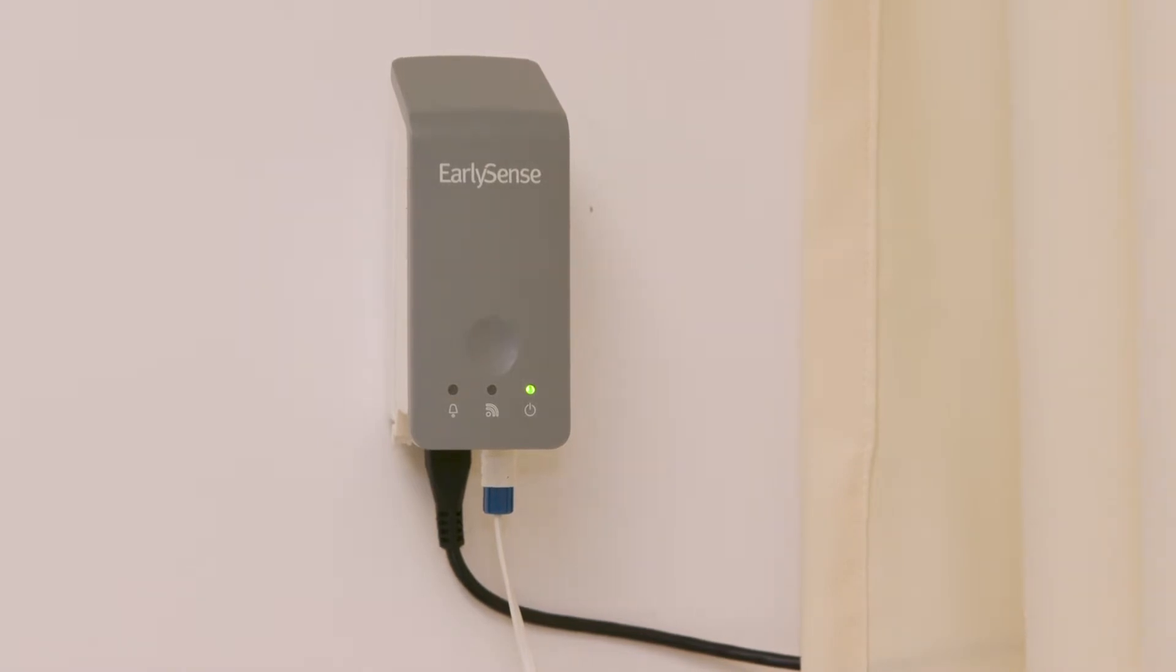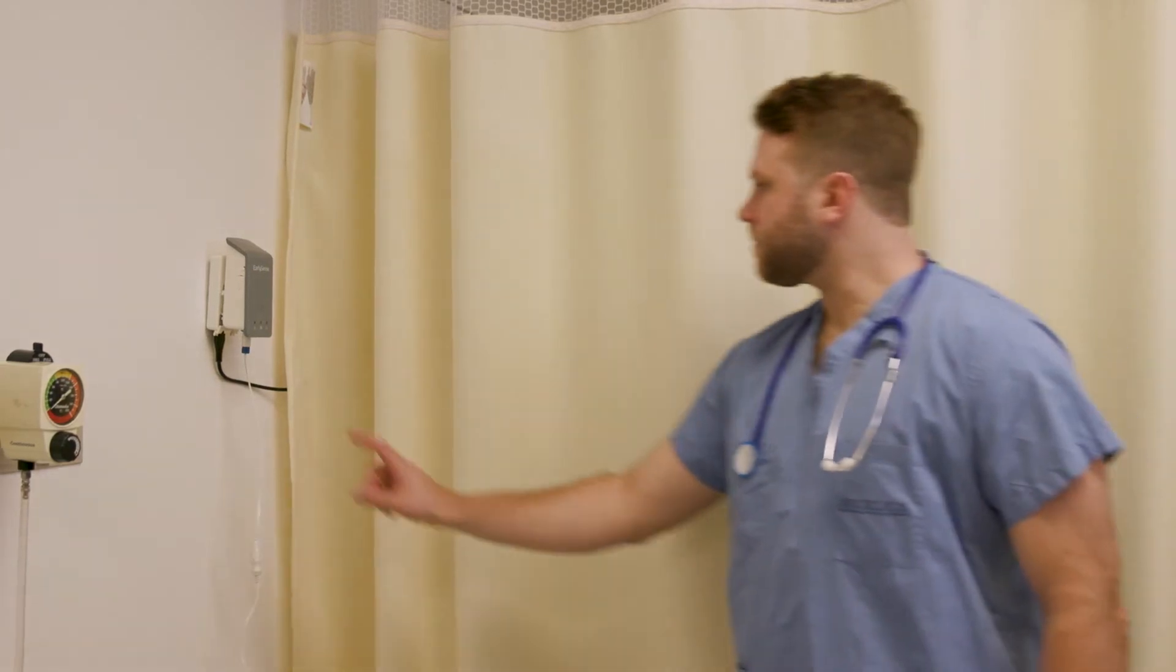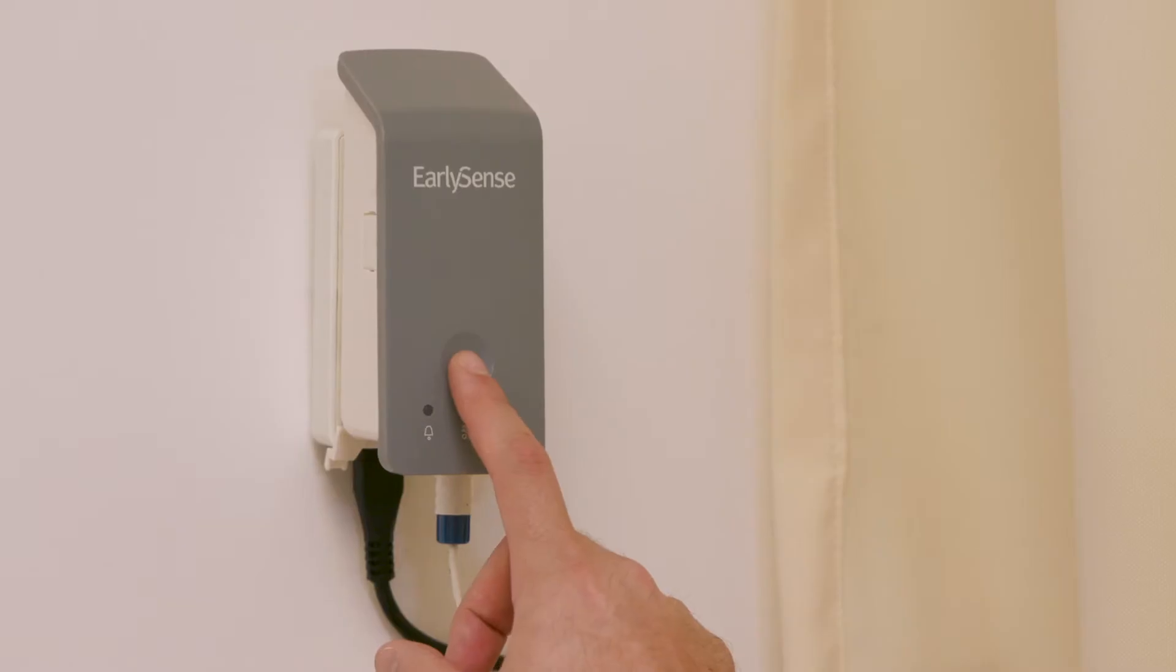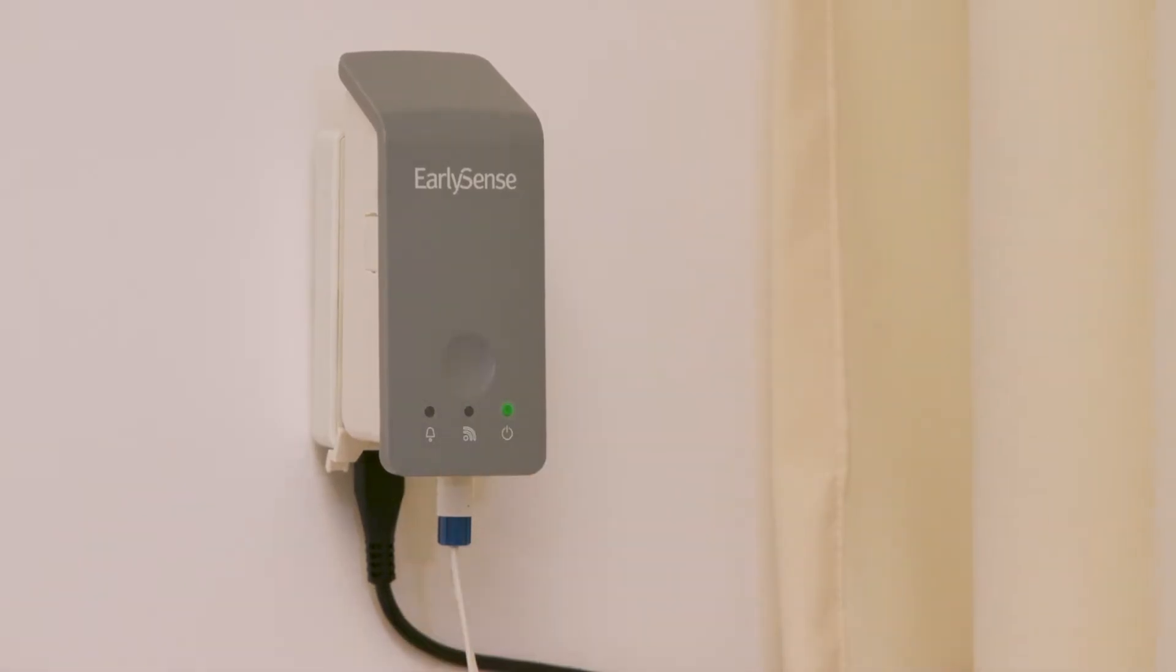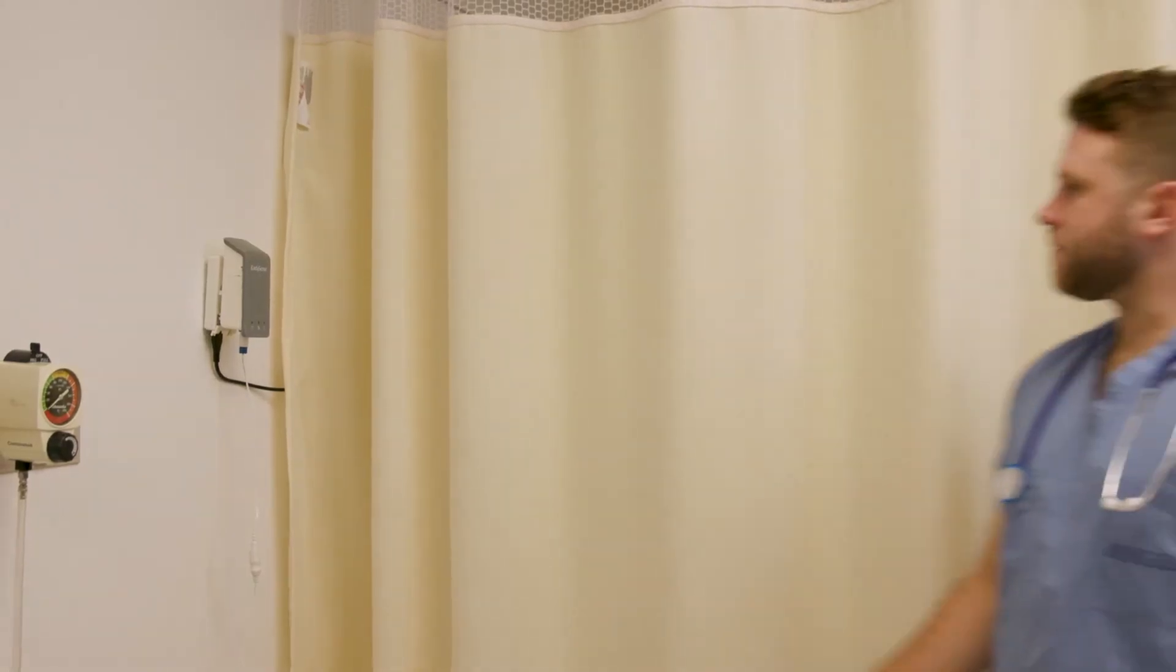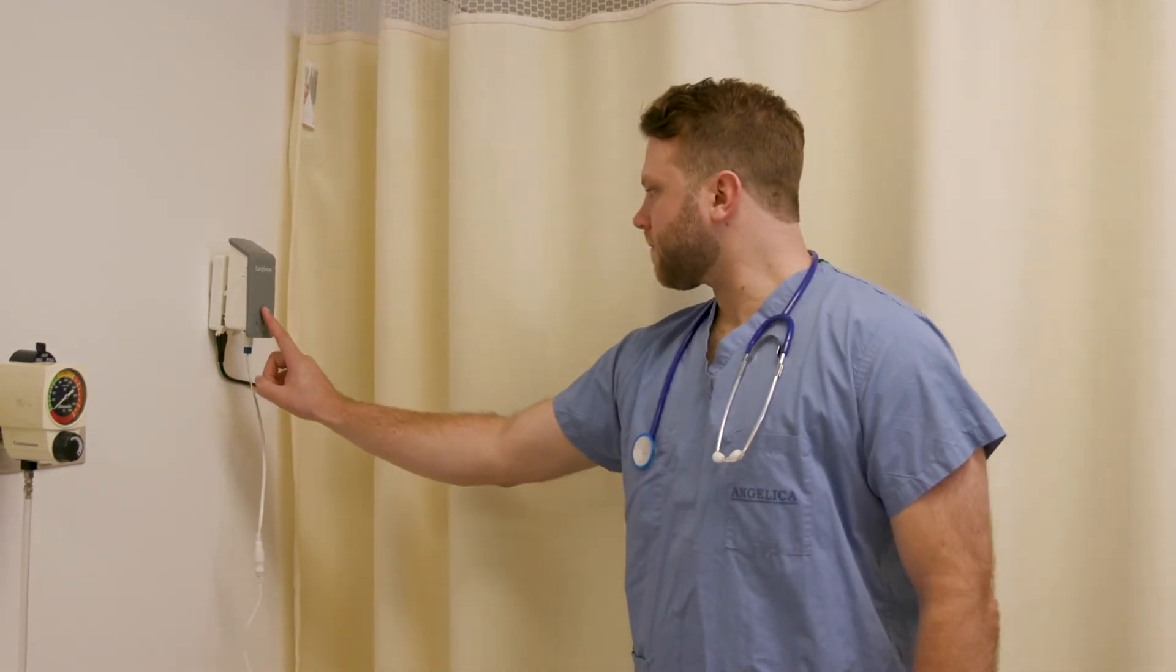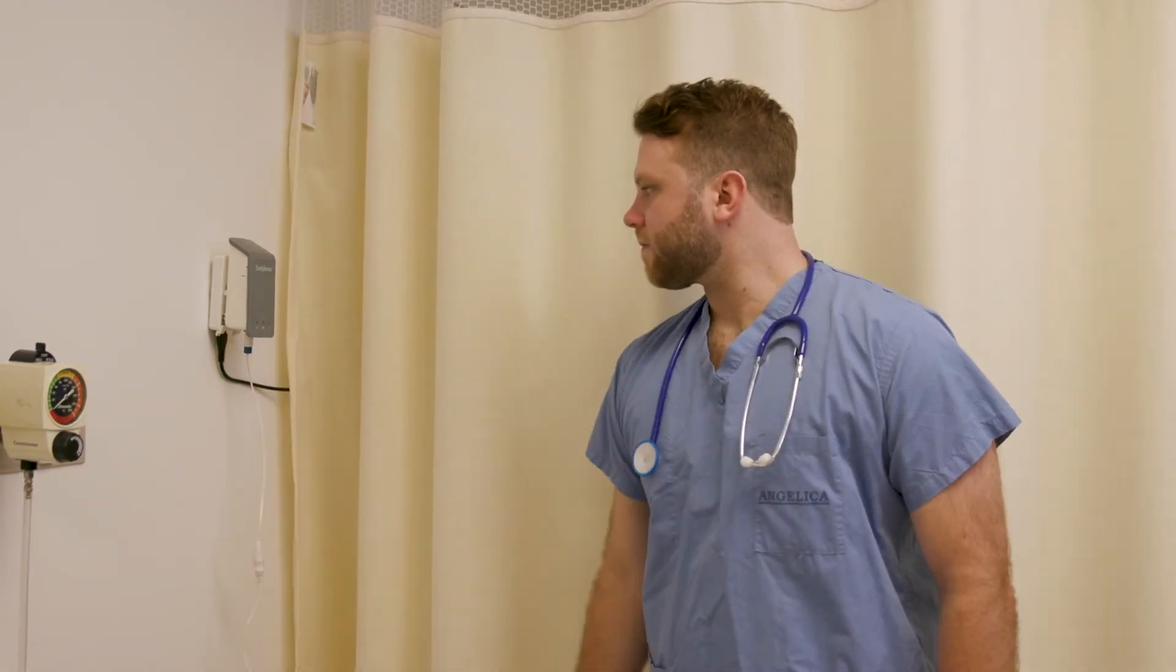In order to acknowledge the alert, you are required to be at the bedside. Simply press the front panel of the Insight device to confirm a turn has been made. Pressing the front panel records the event of the turn and documents it in the EarlySense system.